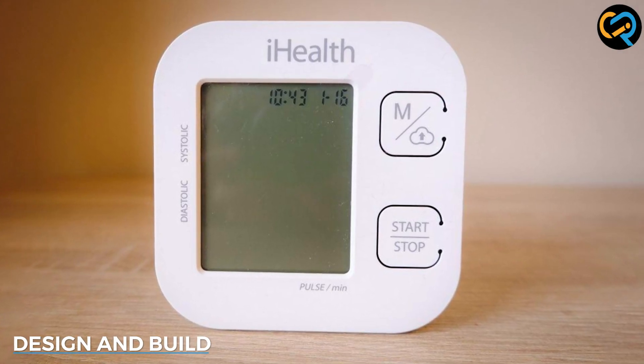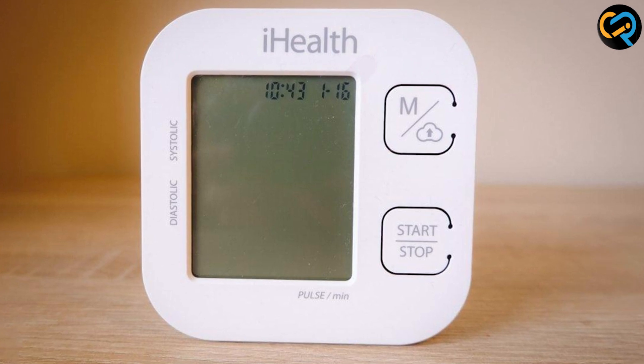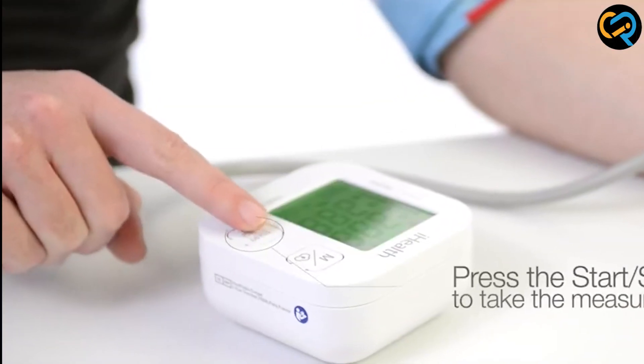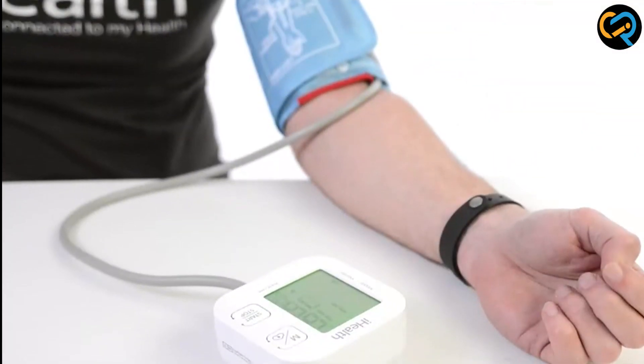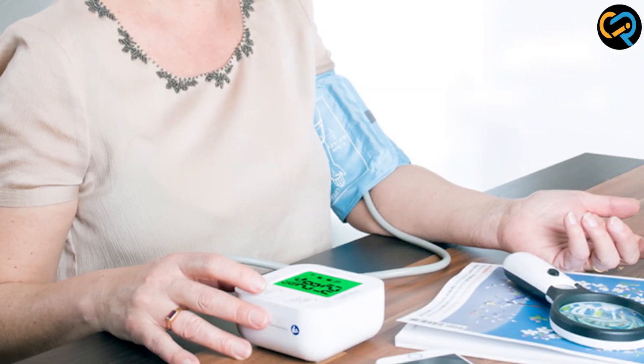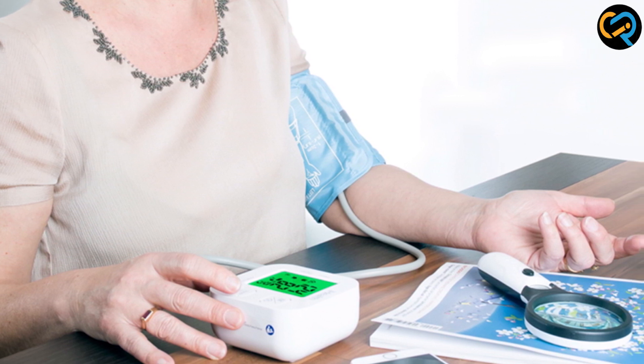The device is sleek and modern-looking with a white and blue colour scheme. It has a large, easy-to-read LED display that shows your systolic and diastolic blood pressure readings as well as your pulse rate. The cuff is adjustable to fit most arm sizes, and it's made of comfortable and durable materials that won't irritate your skin.